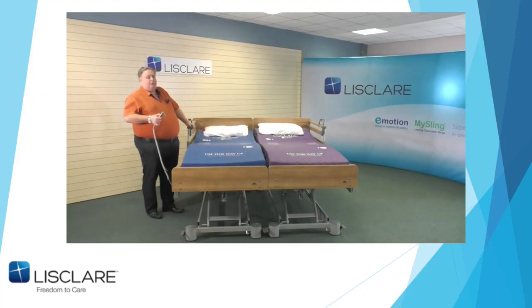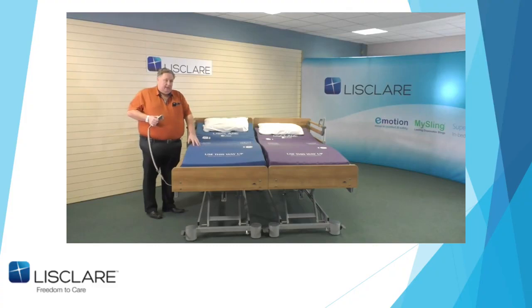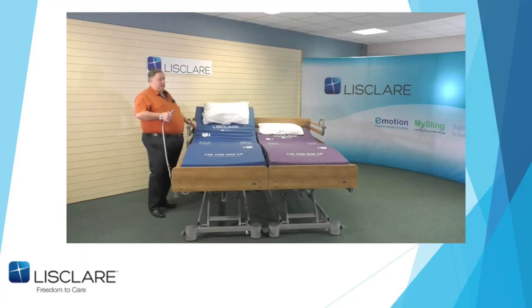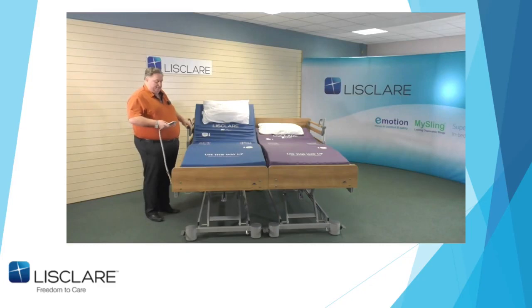But this bed also has what's called auto contour, so it does both together. But technically what you should do is lift the leg rest first slightly, and then lift the backrest up, let the auto contour work, and in 2 weeks' time we'll be doing more about this in bed systems and how this reduces everything on it. But I'll show you one of the tricks of the trade that isn't explained in any of the handbooks of beds. And hopefully you can hear this working.